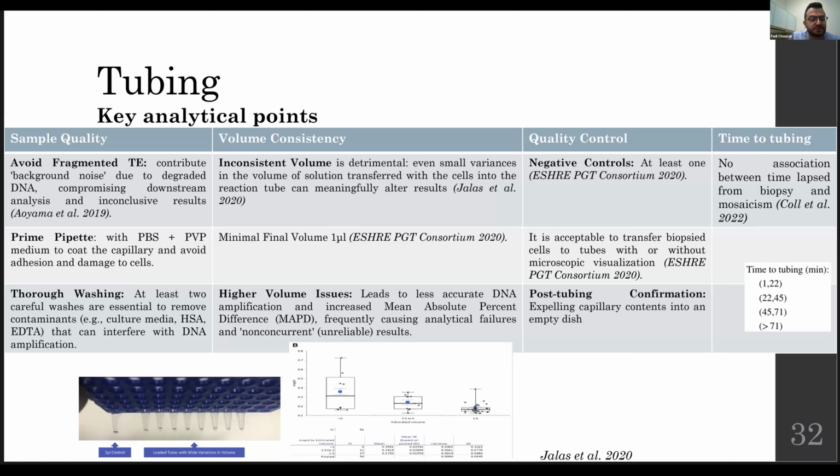You need a careful wash to remove the contaminants from the culture medium. Wash well with PBS because the embryo culture medium contains human serum albumin, which can interfere with the DNA amplification, which is the downstream analysis.